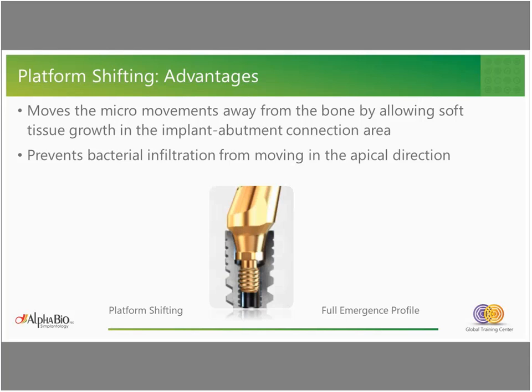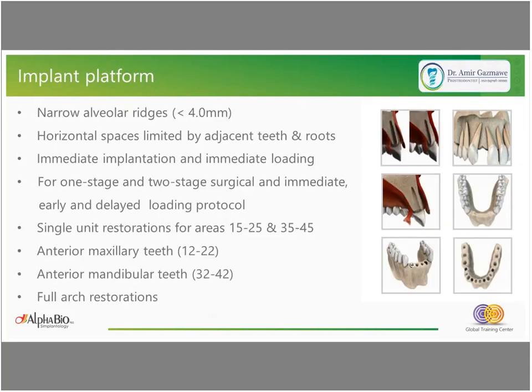The limited space can also be seen when we have orthodontic treatment and closeness between the roots, and we can see that this is also a case that we have to cope with, especially when we have limited distance between roots.